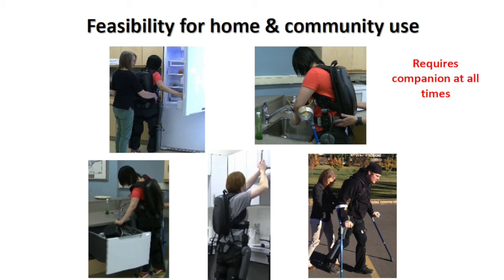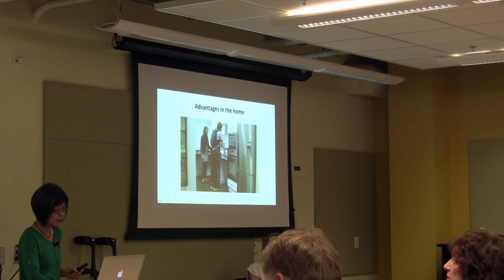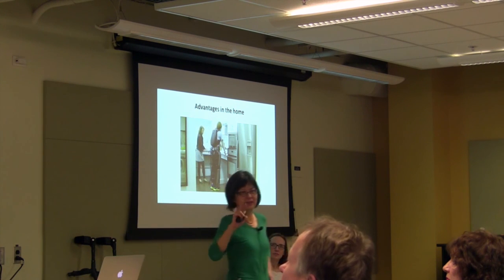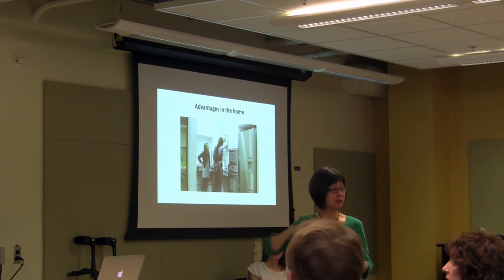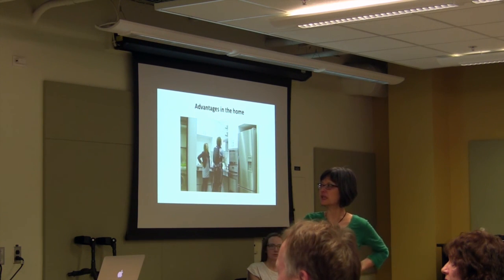But we do test all these things. Because I'm in a rehab department, we have access to occupational therapy and kitchens and things like this. So we test the device in that situation once the people are quite good at it. And this is just showing you 1 video that shows some of the advantages that they like about the device in the home. So cooking, both the two women participants actually loved it in the kitchen because you can cook standing up, you don't burn your arms when you're trying to cook in a wheelchair, and you can do dishes, you can reach top shelves, that sort of thing was quite good.